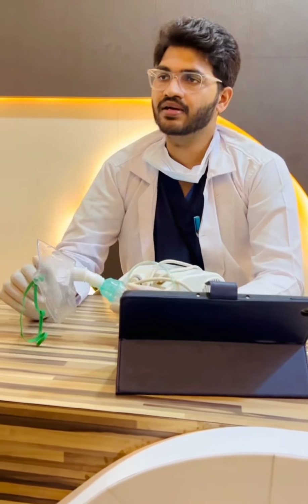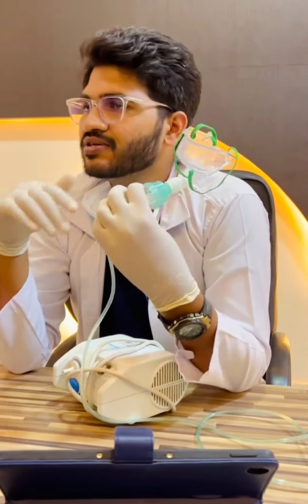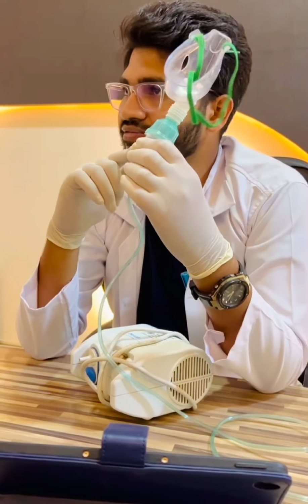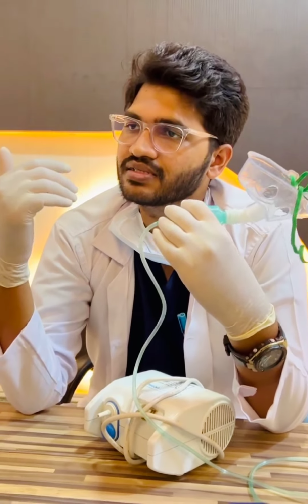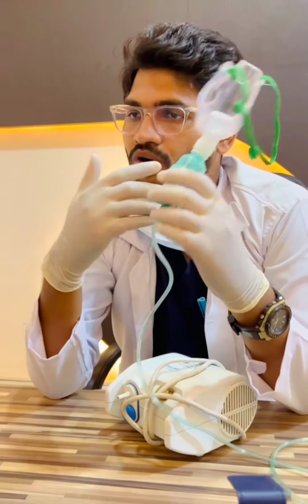Coming to the last type, the nebulizer. This is to deliver certain drugs but not oxygen. It has a chamber where the liquid drug is put, and air or oxygen is passed through the chamber, which turns it into a fine vapor to be inhaled by the patient. The patient will struggle to get a flow of oxygen or air in a nebulizer much above 8 liters per minute, as the back pressure from the chamber will cause it to blow off the wall.